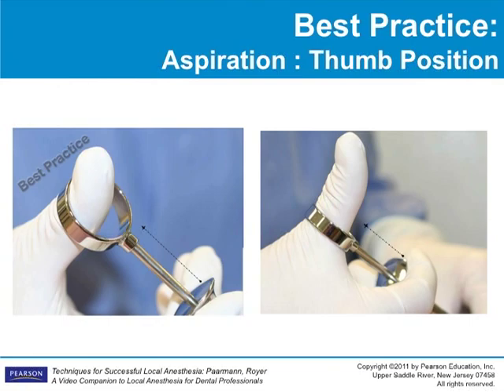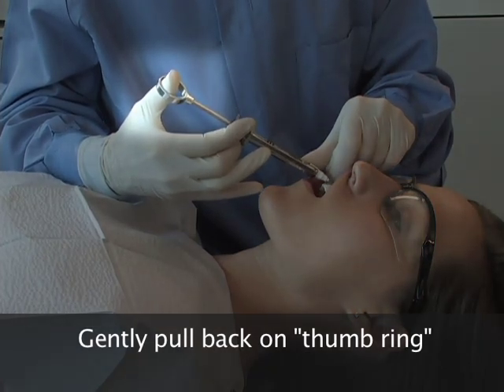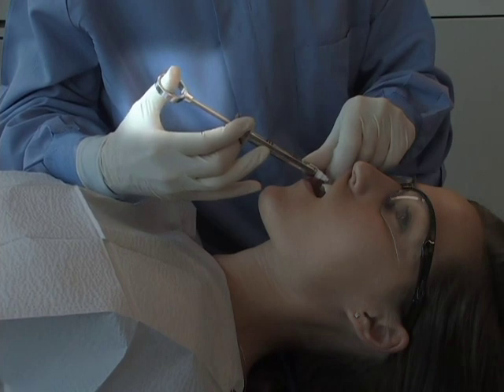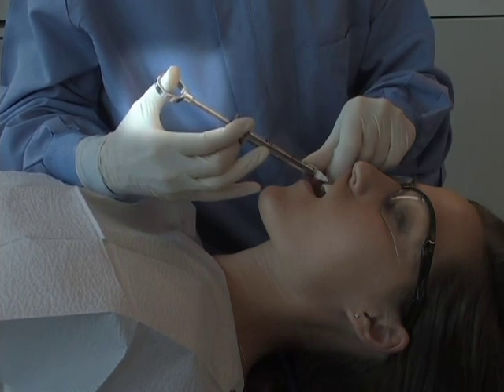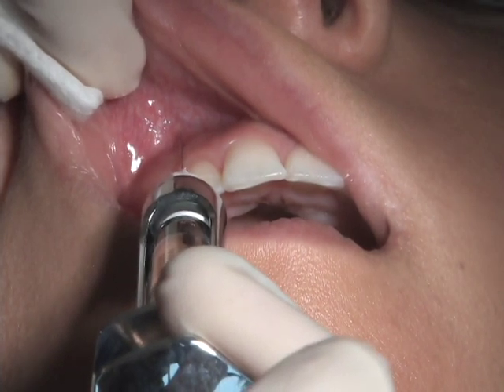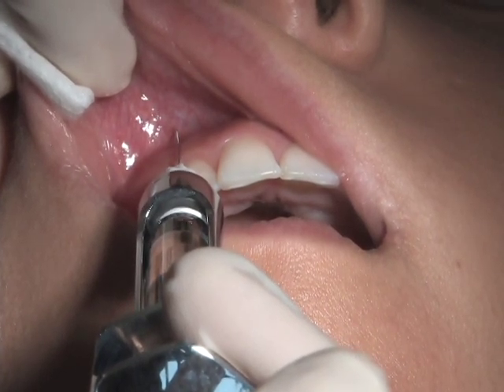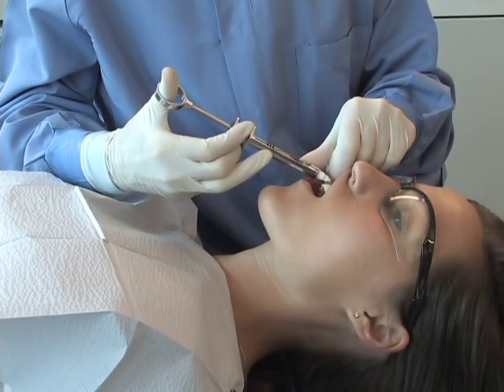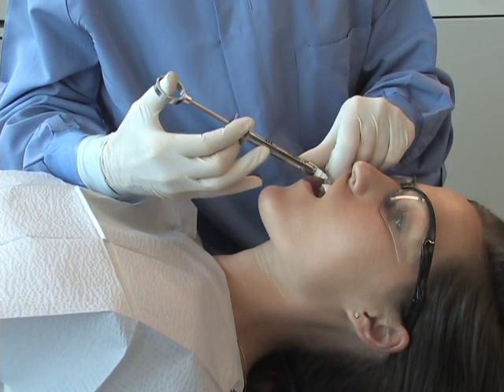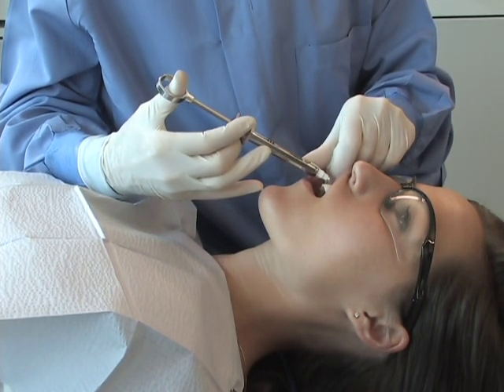Aspirate at the deposition site before depositing solution by pulling back gently on the thumb ring. If the aspiration is positive, blood will enter the cartridge. Even a slight hand movement will relocate the needle tip, resulting in the need to re-aspirate. Relocation of the tip of the needle increases the chance of depositing in a vessel and creating a toxic reaction. If the aspiration is negative, begin to slowly deposit solution. In deeper injections and highly vascular areas, such as the posterior superior alveolar or the inferior alveolar, more than one aspiration should be performed. Aspirating on two different planes is recommended to assure that the lumen is not blocked. If the depth of the needle changes at all during the injection, be sure to re-aspirate.